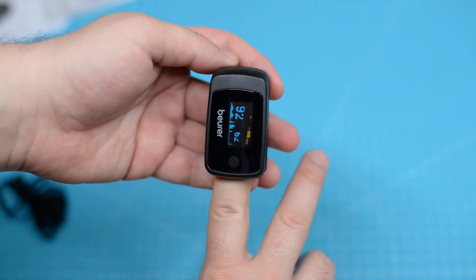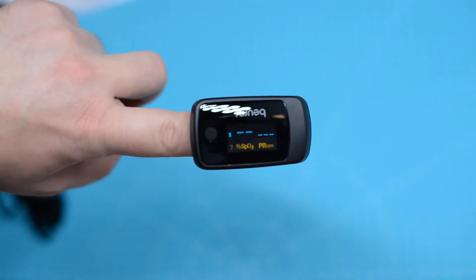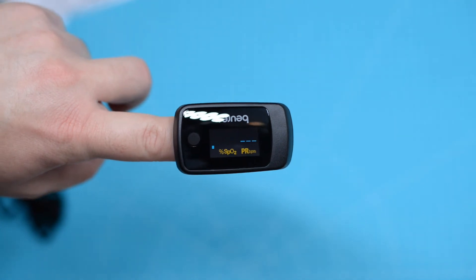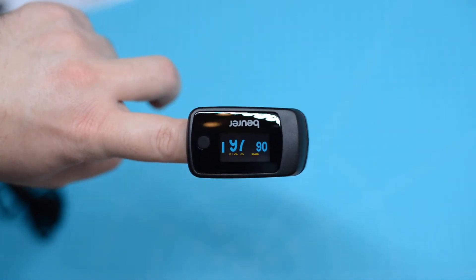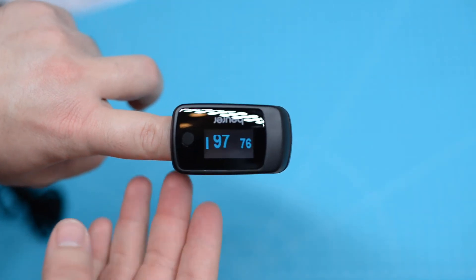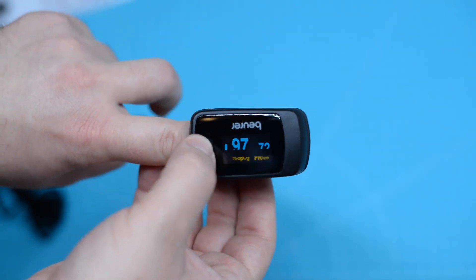I didn't push my finger all the way in. But after taking a couple of steps and coming back to it, it showed this. As a rule of thumb, it's better to have a value over 95 shown on the display. Also take a couple of steps before using it for a reading.